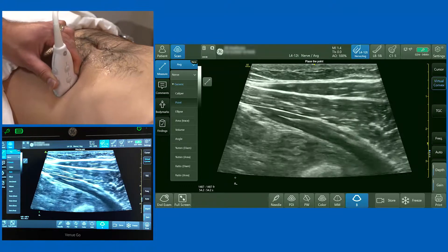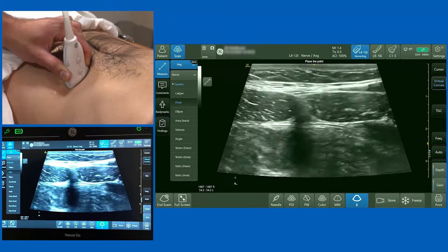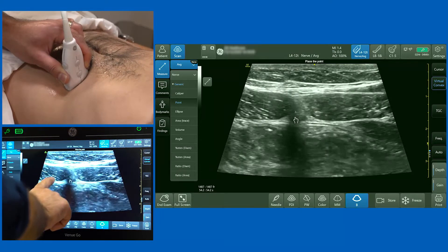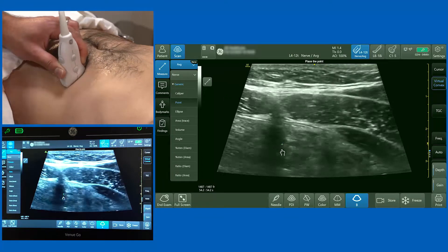Having identified those three muscles, I'm now going to slide the probe towards the midline. As we do that, you'll see a very obvious internal oblique muscle, and at this point in the middle of the screen we've got an ultrasound landmark that correlates with the linea semilunaris, which is the lateral aspect of the rectus abdominis muscle on this side.